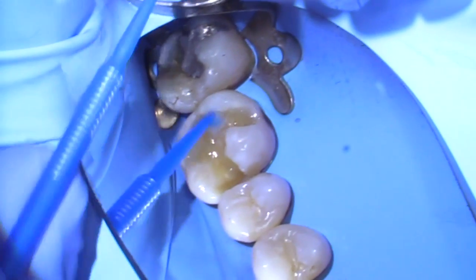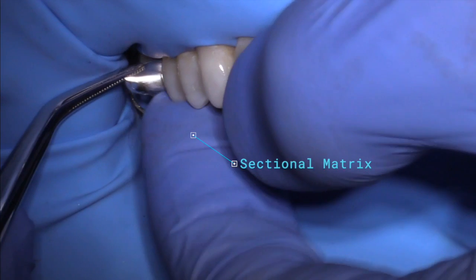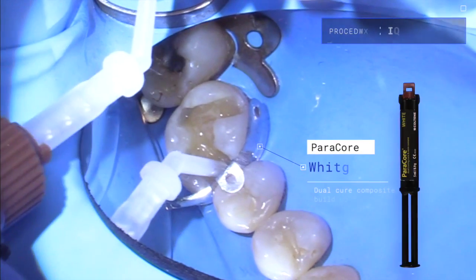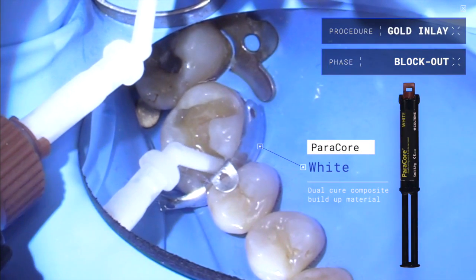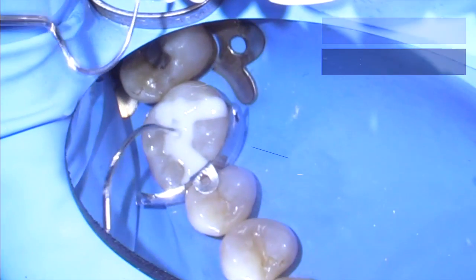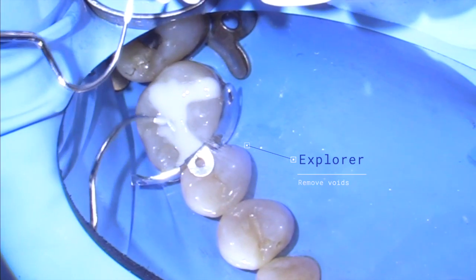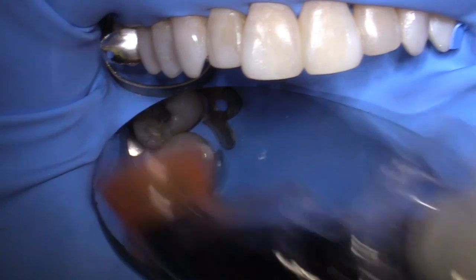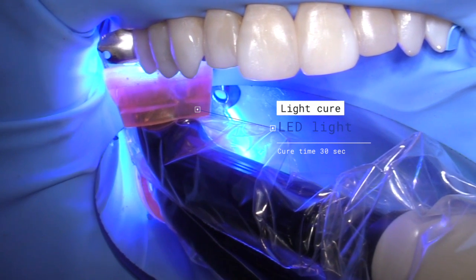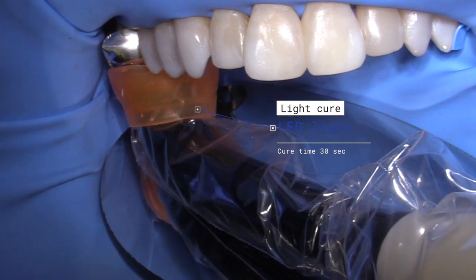At this point we're ready to place the Parabond. Let's put a little matrix in there just to keep the adjacent tooth from getting too much debris on it. Notice the bright white product. This product will light cure much faster — it will set much faster with the light cure as well. Notice how Ermie holds the light for a few seconds before she drops it on top of the materials. That's the technique called Hover and Drop. She's going to go ahead and light cure that again for a 30 second cure.